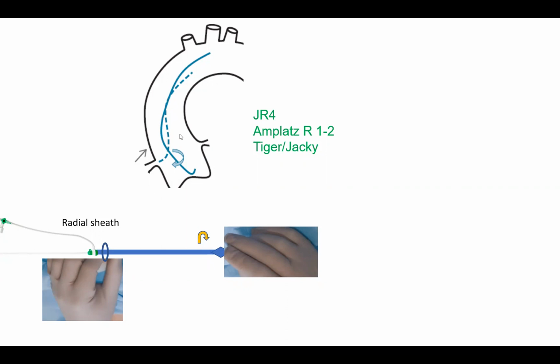If you torque in place and you don't see anything happen, then when the torque gets transmitted, you'll end up with a catheter doing 360 degrees and going back in place. So you want to see that catheter moving as your hands are moving. Otherwise, you'll get stored torque and very swift transmission into 360-degree torque at some point.